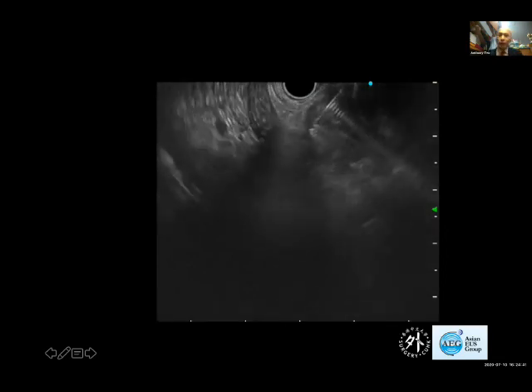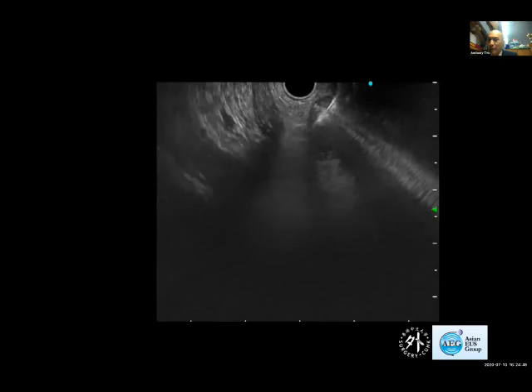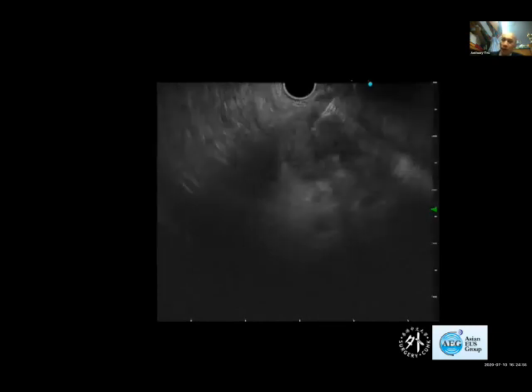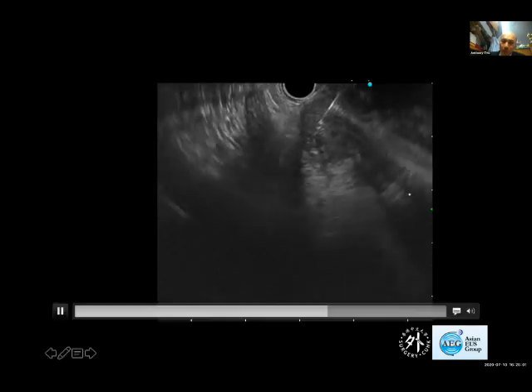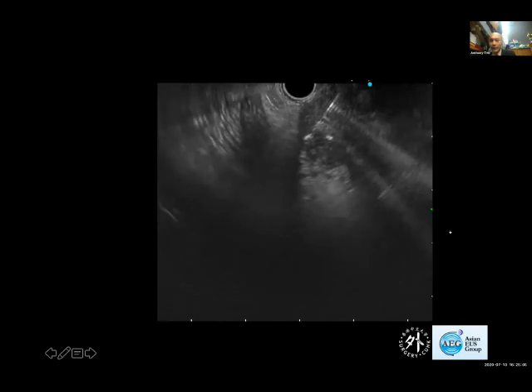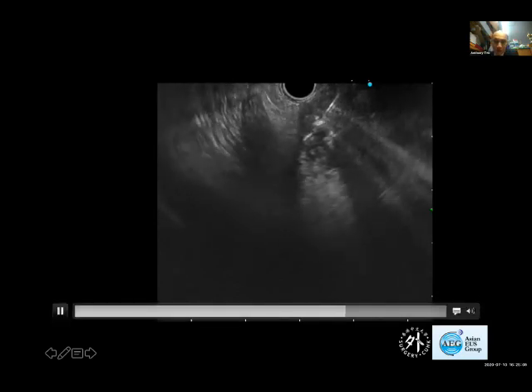Of course, the most worrisome risk of this procedure is pancreatitis. Somehow for pancreatic cancer, I think the risk is lower because these patients already have a tumor right there, and also the PD is obstructed very early on in the disease. So again, studies are ongoing, assessing the efficacy of RFA. Hopefully we will know the results very soon.